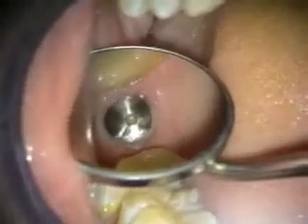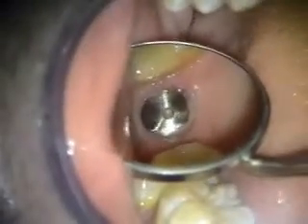This is a three-month healing of the implant in the number three site. Take a look at the x-ray next.